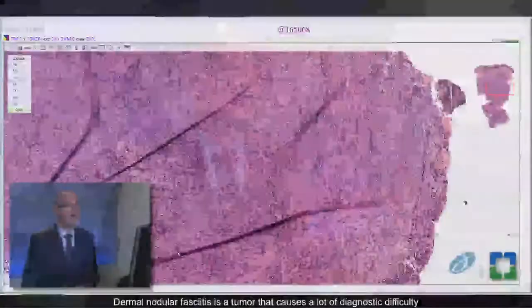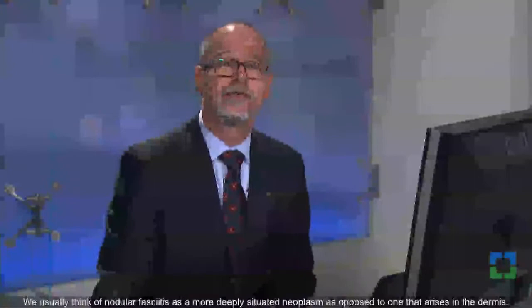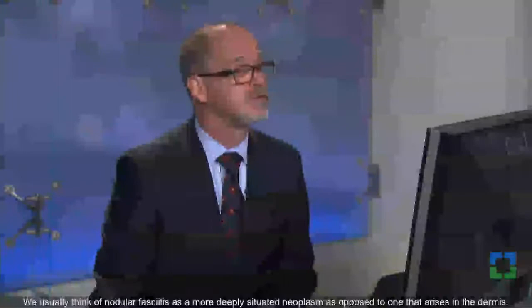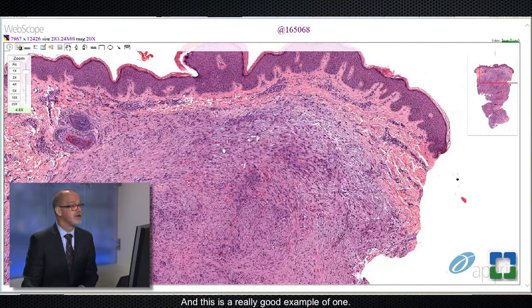Dermal nodular fasciitis is a tumor that causes a lot of diagnostic difficulty because this is not the normal location for nodular fasciitis. We usually think of nodular fasciitis as a more deeply situated neoplasm, as opposed to one that arises in the dermis. But not uncommonly, at least on our consultation service, we see a fair number of cases of dermal nodular fasciitis every year. And this is a really good example of one.